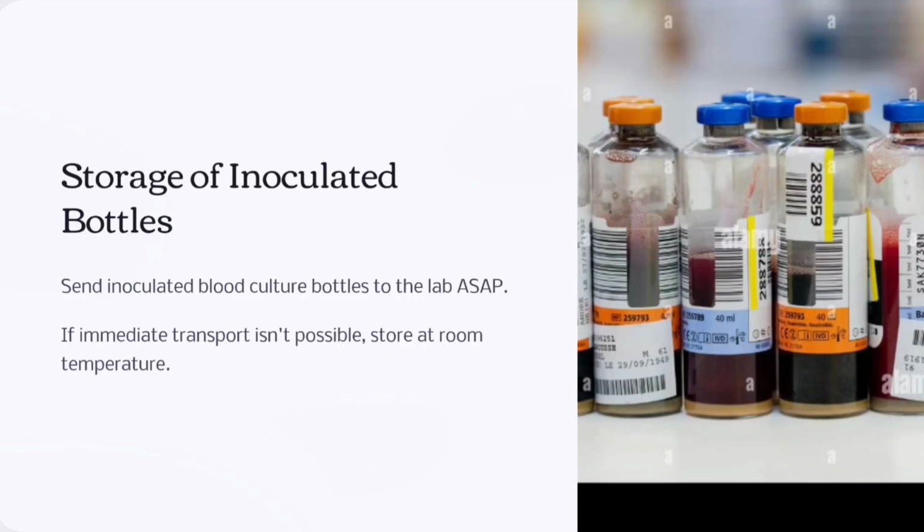Now, if you have drawn the sample and inoculated it into the bottle, you should send these bottles to the lab immediately. In case this is not possible, then these bottles should be maintained at room temperature, and they should not be refrigerated.